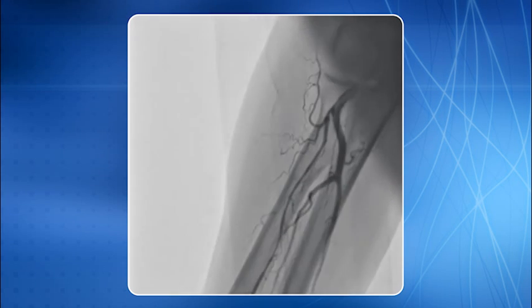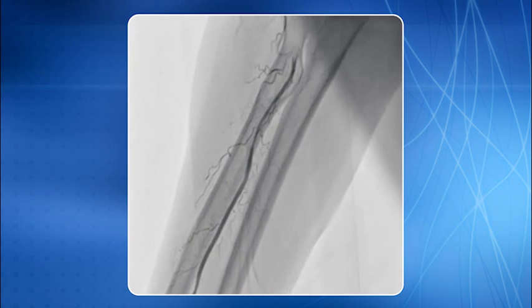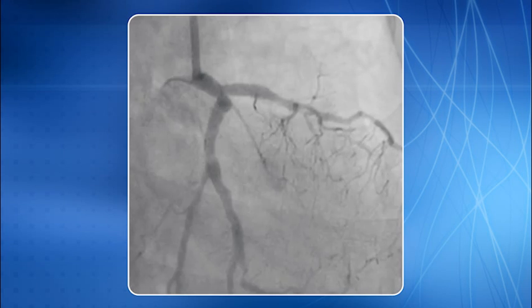Here is a case where we need to do a left main bifurcation stenting using a 7F extra backup guide catheter, and you can see a very small caliber of radial artery through which we need to negotiate a 7F EBU guide catheter. Repeat spasmolytic cocktail showed some improvement, but not good enough to track a 7F guide. As discussed, we performed balloon assisted tracking. A complex LMCA bifurcation lesion is seen now. Optimal end result is seen now.